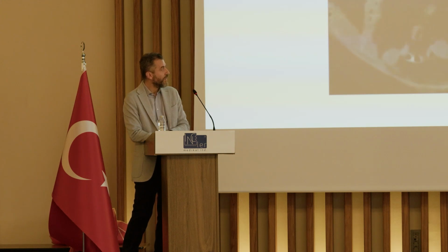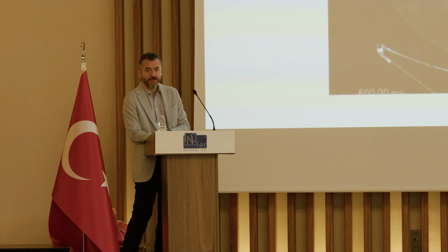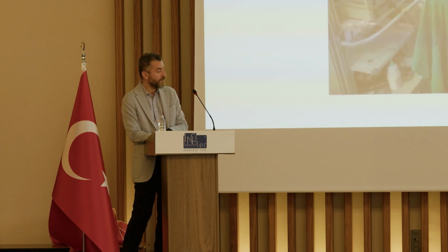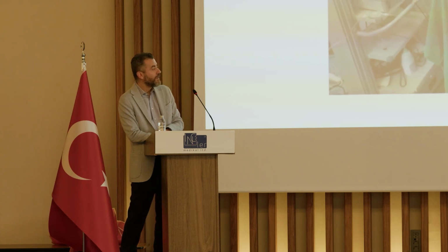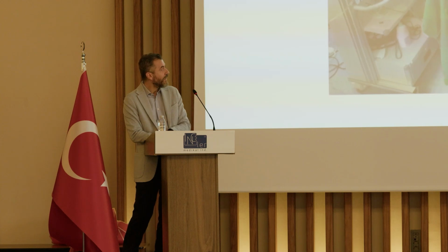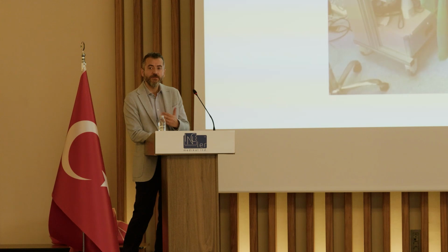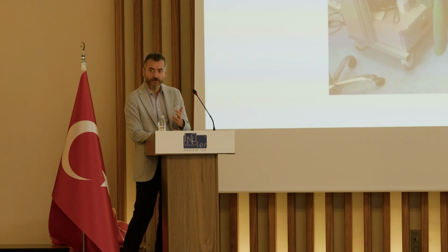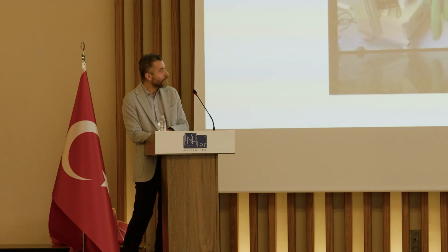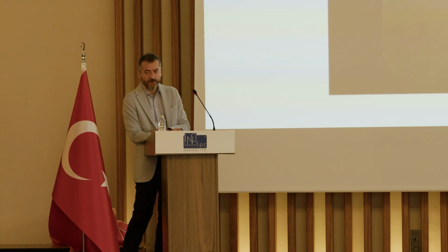However, with the standard PCNL, in this case, we have a very huge stone inside the kidney in different parts. This is a 5 centimeter maximum diameter, and with the 3D volume, it's really very huge. So we are now working through a 24 French sheath, and the nephroscope that I use is 19.5 French in diameter, and it lets me use up to 12 French working instruments. By this way, I'm using a 9.9 French ultrasonic probe here, and very efficient lithotripsy is possible.